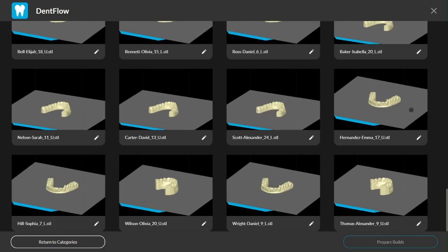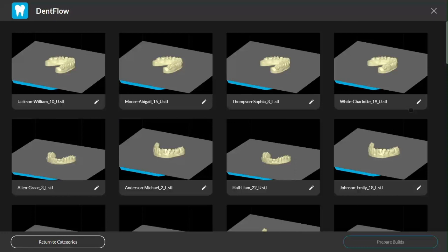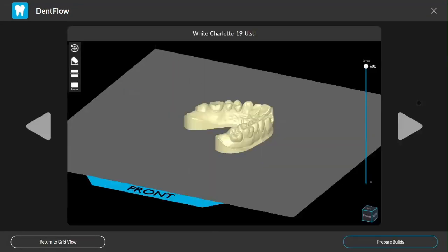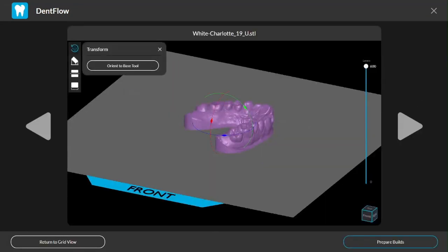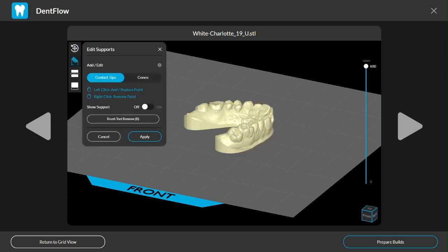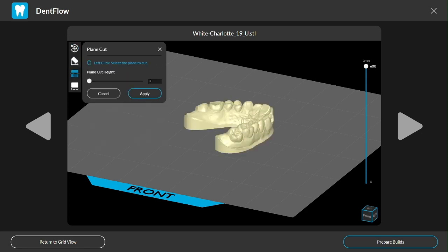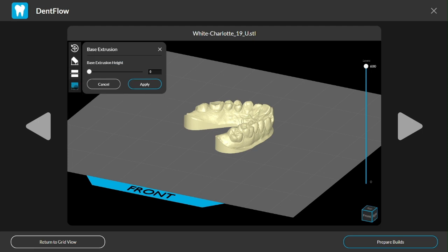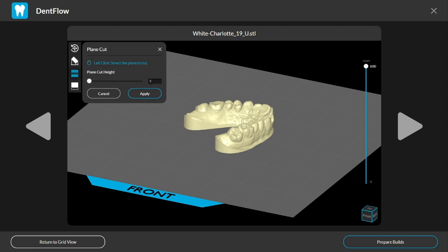DentFlow also has a few powerful editing tools you can use after importing all your models. There's the ability to tweak the orientation if I don't like what it gave me. I can edit individual support points as well. And perhaps most excitingly, DentFlow gives me the ability to cut my model down in height or extrude my base.